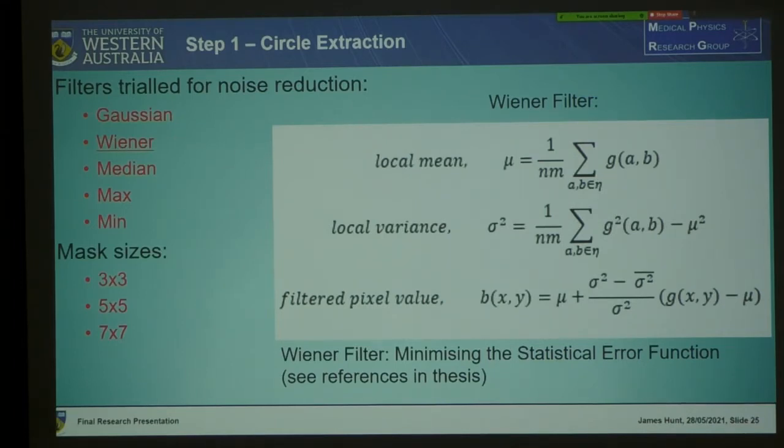Gaussian is also known as a smoothing filter. It doesn't use a mask size. It uses a sigma. If you know the shape of a Gaussian function, it peaks in the middle and then drops out to either side. I couldn't put one in, sorry. So basically the value assigned to a pixel is mostly defined by the central pixel, and to lesser degrees by the pixels around it. The further the pixel is, the less it influences the final value, but that causes a lot of smoothing.